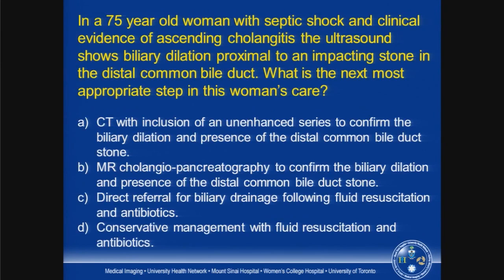So we're going to do another question. A 75-year-old woman presents with septic shock, clinical evidence of ascending cholangitis. The ultrasound shows biliary dilation proximal to an impacting stone in the distal common duct. What's the next most appropriate step in this woman's care?